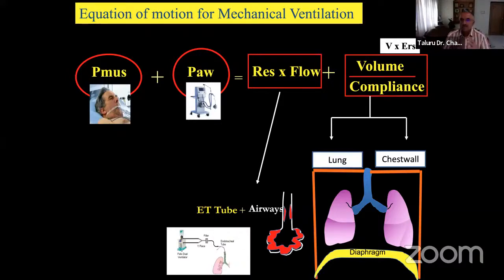For example, when we have intubated a patient with a cardiac ejection fraction of around 30-40% who comes for surgery, suddenly the patient may develop pulmonary edema. Then the contribution is from the lung. Or when you put in pneumoperitoneum for laparoscopic surgeries, or when you do some positional alterations, if the plateau pressure suddenly goes up, then it can be the chest wall. So the differentiation can only be made scientifically by putting in an esophageal balloon for estimation of pleural pressure.